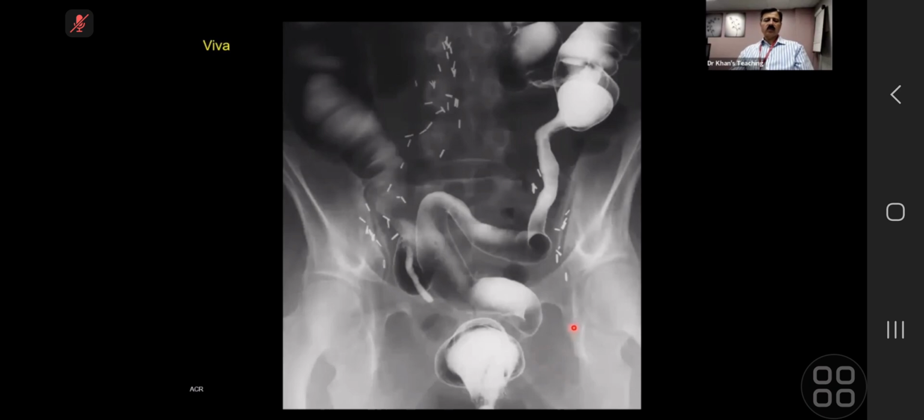Overall, in the exam, they will always show you post-radiation where there will be some stigmata of old surgery, like this or some other on a CT scan, because they will show you a story, develop that story, and the story is that the patient had surgery.